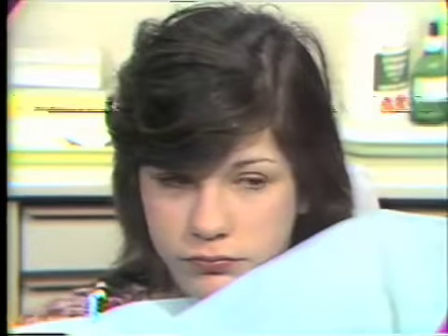We'll bring Carolyn back in another 2 weeks and do the same procedure again. Usually we'll do this procedure for about 3 times, perhaps 4, and usually that's about the maximum amount of lightening that we can expect. When Carolyn comes back, I would expect the teeth to be just a little bit darker than we saw today, but this is the usual procedure.